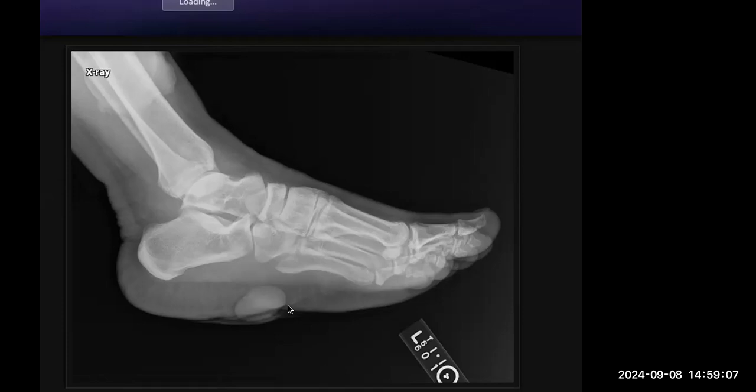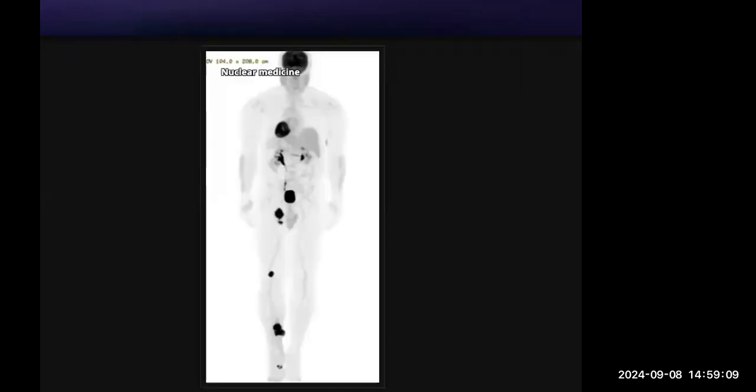The nuclear scan showed uptake in the lesions that we saw in X-ray, and there was also inguinal lymphadenopathy along with it. So this was a case of melanoma. Sometimes they can show you melanoma-like soft tissue lesions on an ultrasound or an X-ray, and then they can take you there and discuss nuclear and so on. So I think it would be a good idea to learn differentials of soft tissue masses in all the planes: intramuscular, subcutaneous, fat, etc.